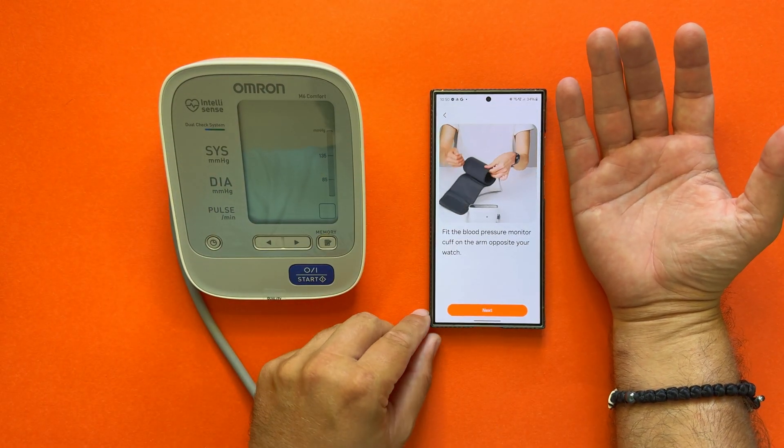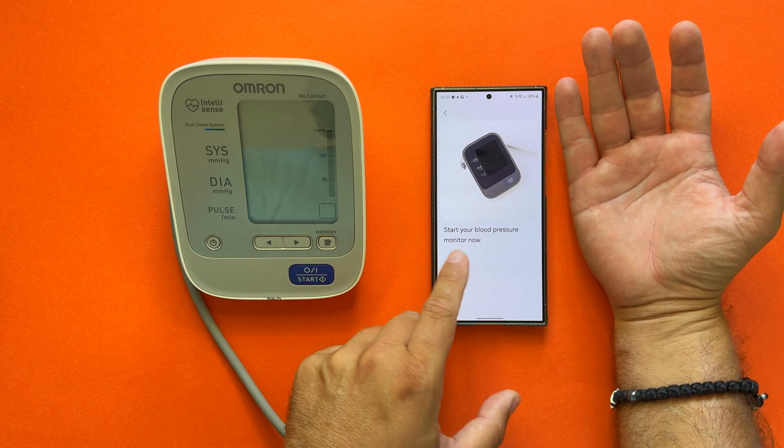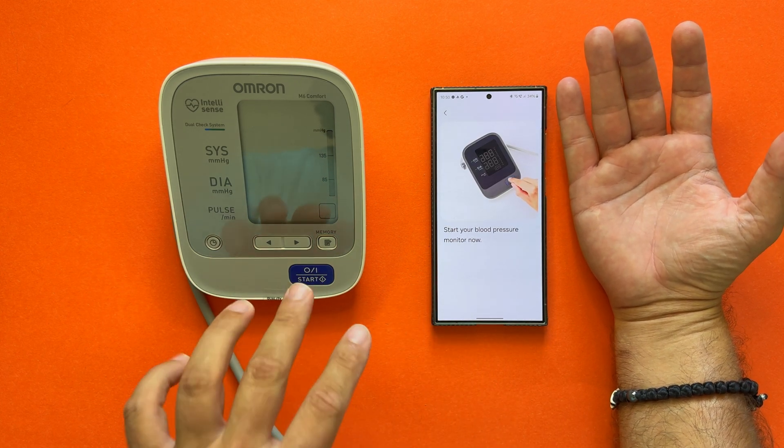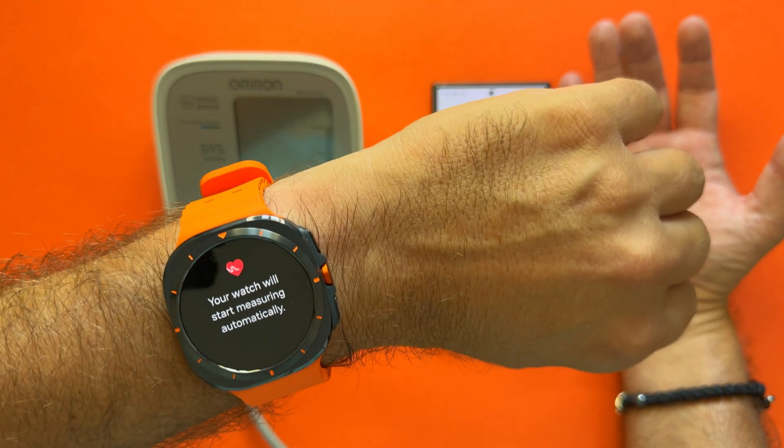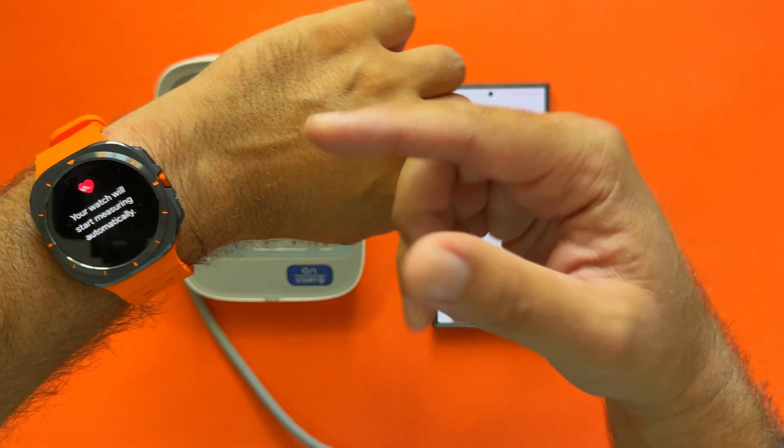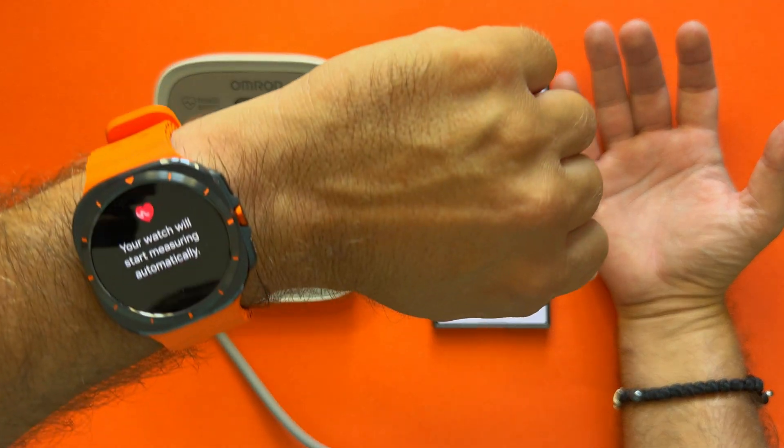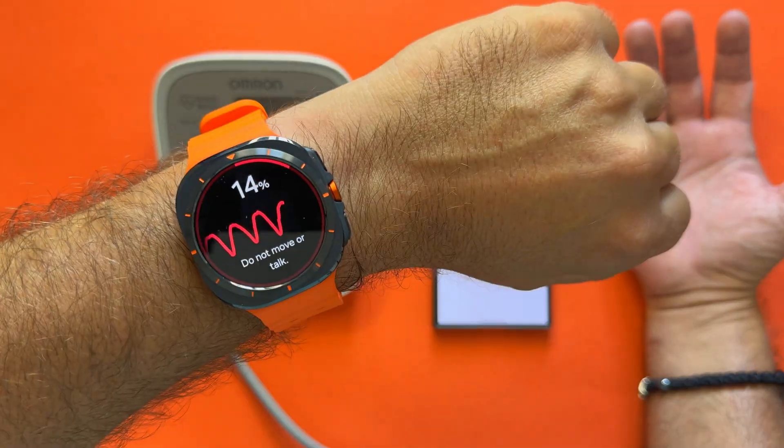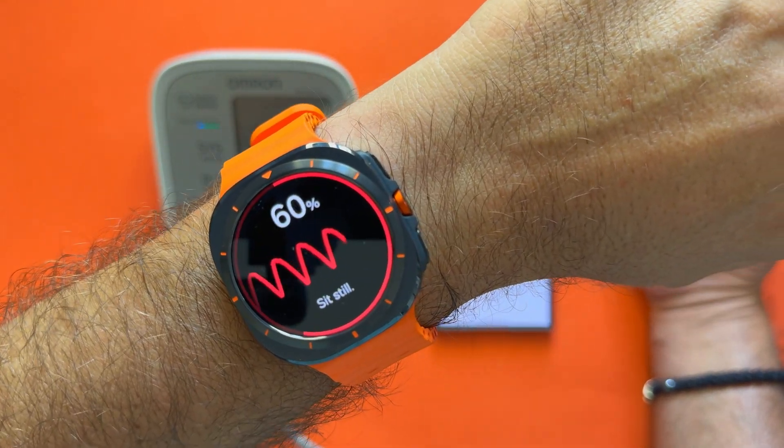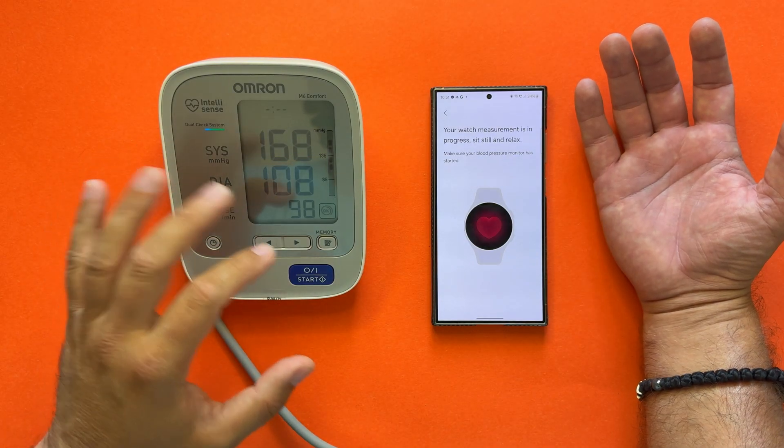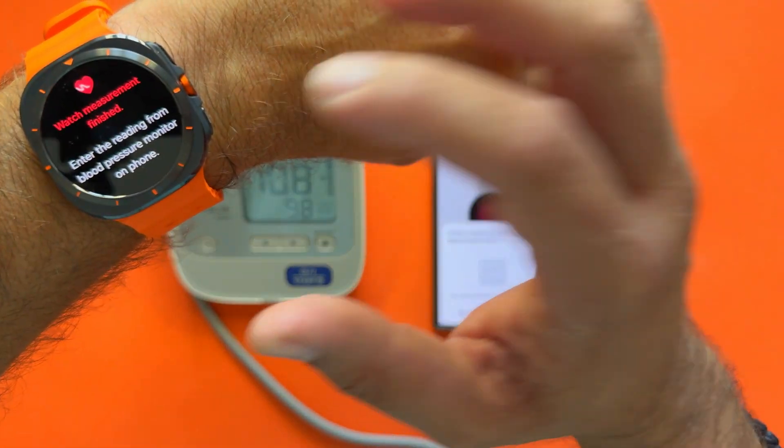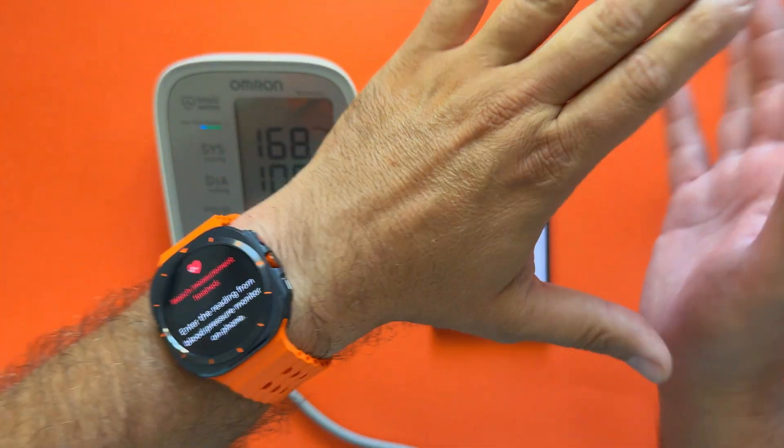I will now link it to my blood pressure monitor. I'm going to put my hand like this, then press Next. Start your blood pressure monitor right now. The moment I started, you're going to see the Galaxy Watch will also start. Your watch will start measuring automatically. 168 over 108. I know this is very very high, but again, I took coffees in the morning.